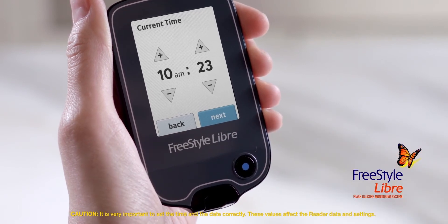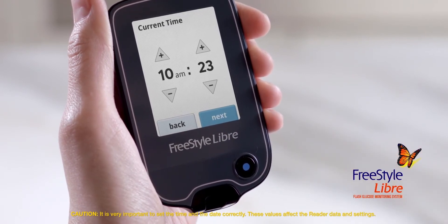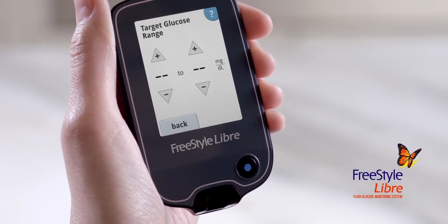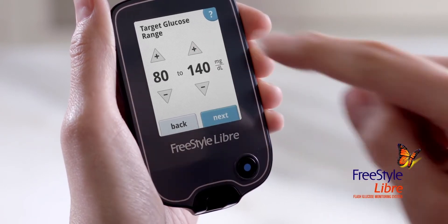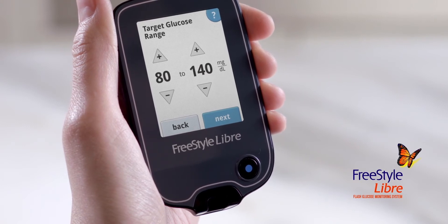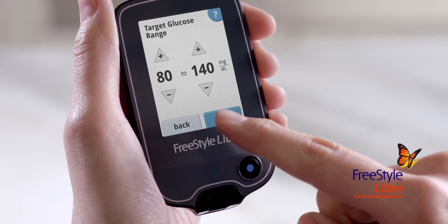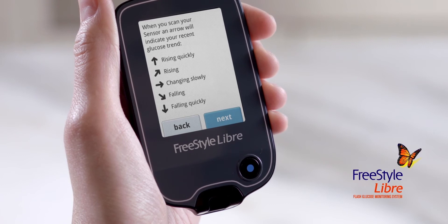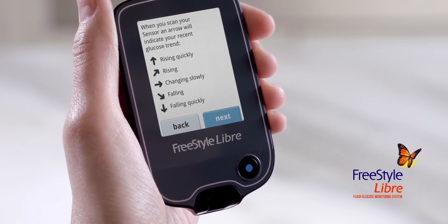Now you can set the current time. Tap Next to continue. Next, you can set your target glucose range based on your healthcare professional's recommendation. Your target glucose range is displayed on glucose graphs on the reader and used to calculate your time in target. Tap Next to continue. Finally, the reader will lead you through two informational screens about reading the trend arrows and how to return to the home screen. Read each to finish the setup. Now your setup is done.